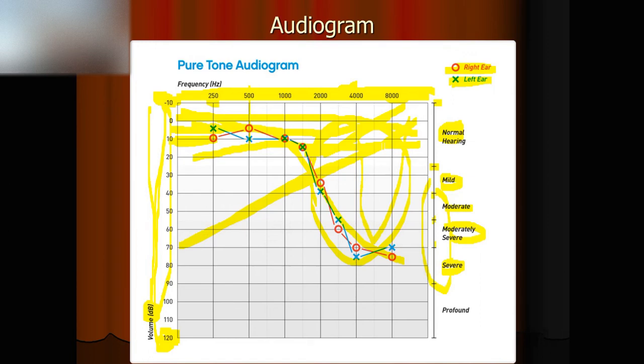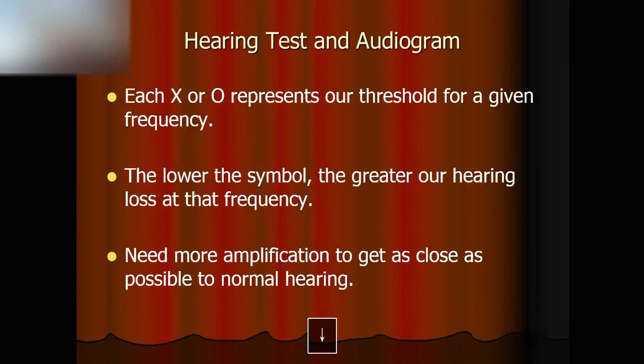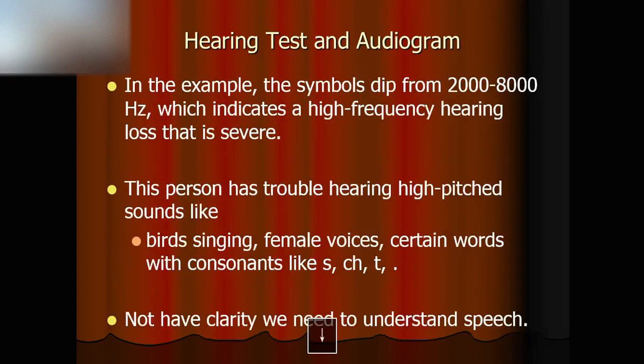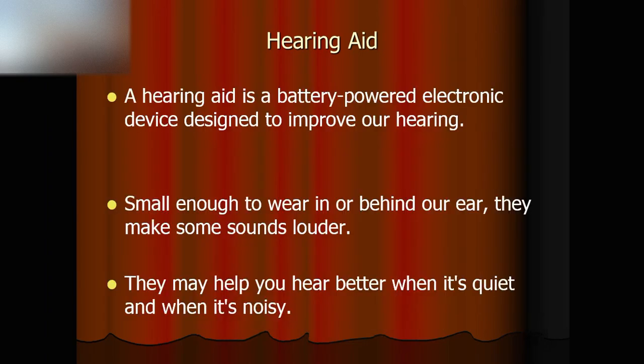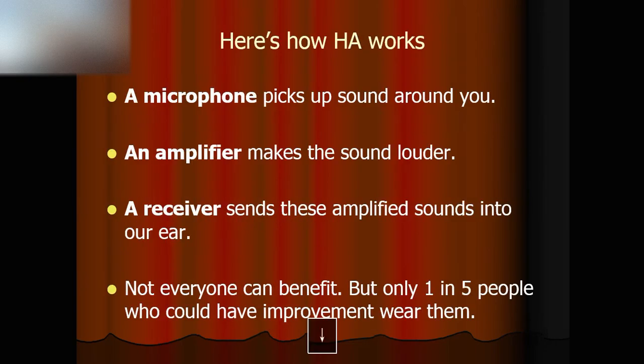So most of the power of the hearing aid will be used to enhance the amplitude of high frequency components. So that's the hearing aid amplifier.